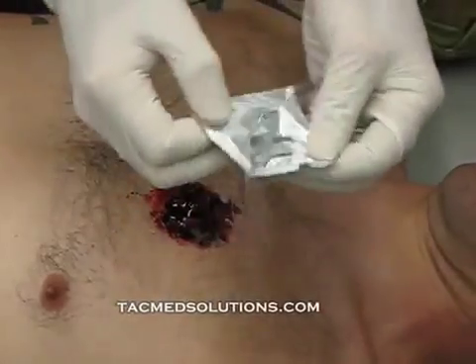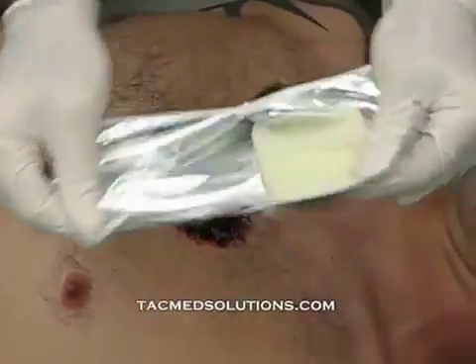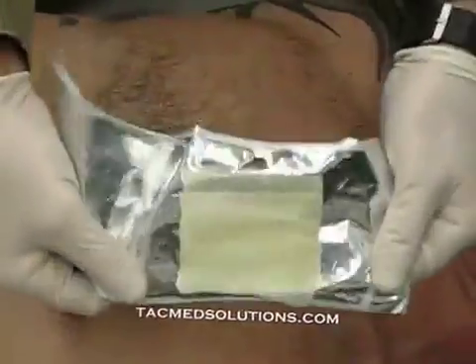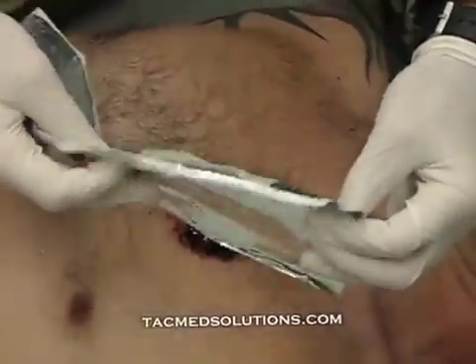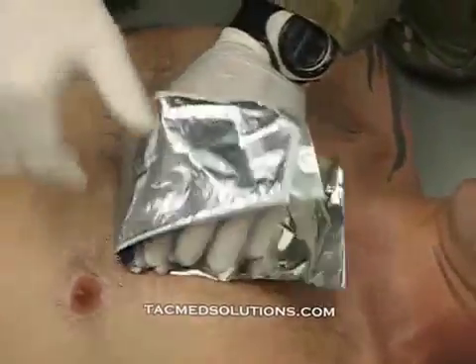Open the package with the provided flaps to expose the petroleum gauze. Place the gauze and wrapper directly on top of the wound site and remove the other half of the wrapper.